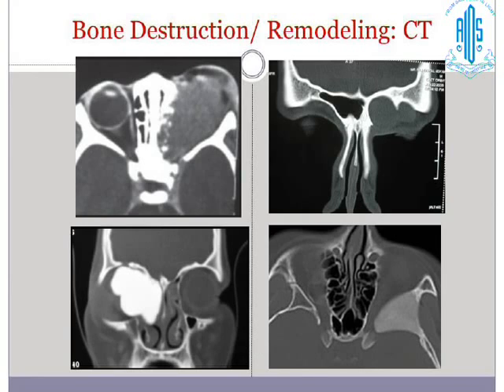Now, bony destruction can be so much better seen on a CT, in this patient of a retinoblastoma, a scalloping in this patient of a frontal sinus mucocele, osteoid osteoma, ivory osteoma, a dense compact bone. This information, which is so easily obtained on a CT, cannot be obtained on an MR. Again, a very ground glass looking appearance of fibrous dysplasia.